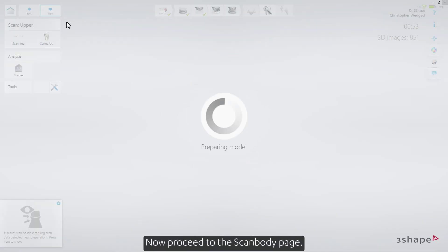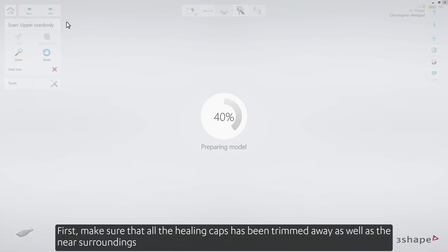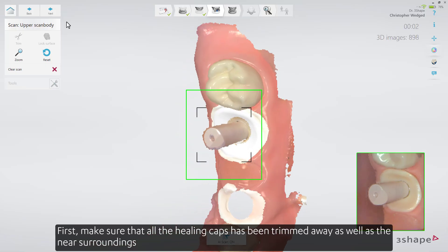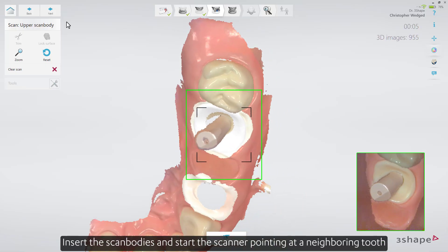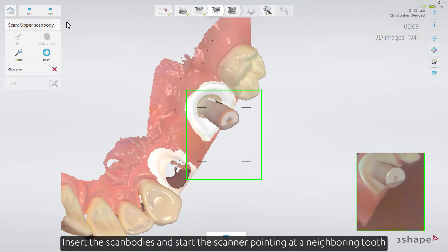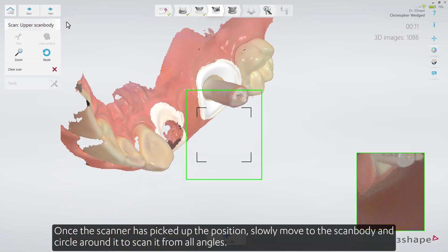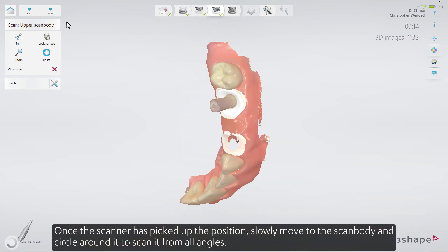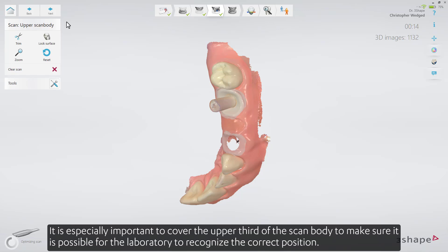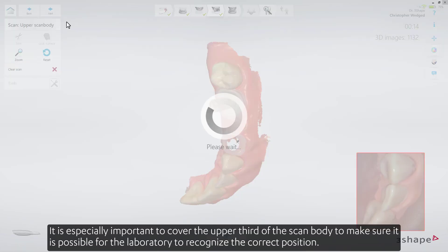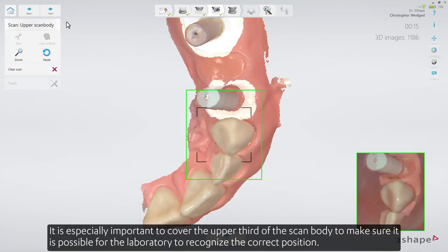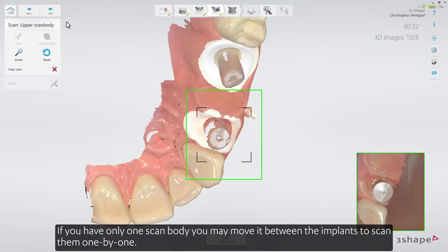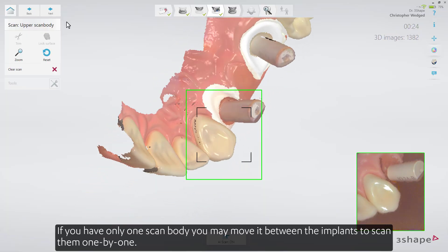Now proceed to the Scan Body page. First, make sure that all the Healing Caps have been trimmed away, as well as the nearby surroundings. Insert the Scan Bodies and start the scanner, pointing at a neighboring tooth. Once the scanner has picked up the position, slowly move the Scan Body and circle around it to scan it from all angles. It is especially important to cover the upper third of the Scan Body, to make sure it is possible for the laboratory to recognize the correct position. If you have only one Scan Body, you may move it between the implants to scan them one by one.